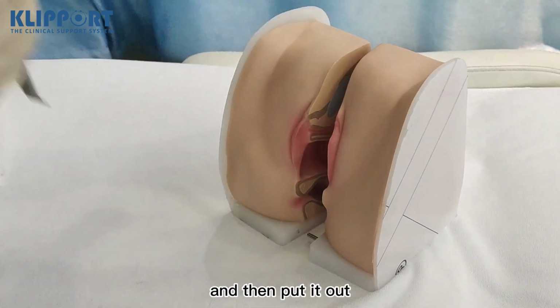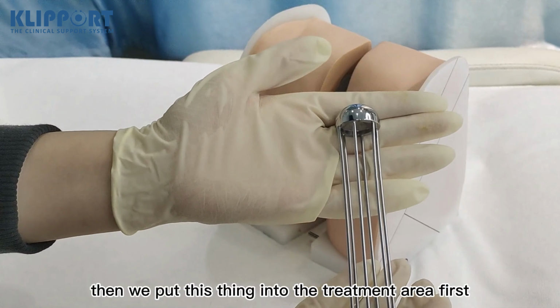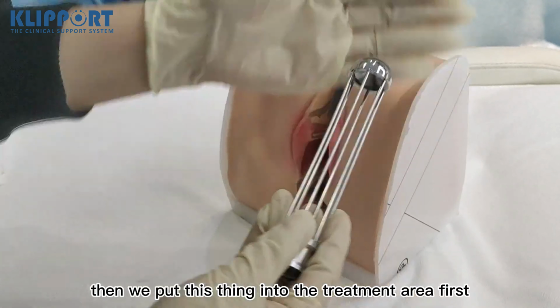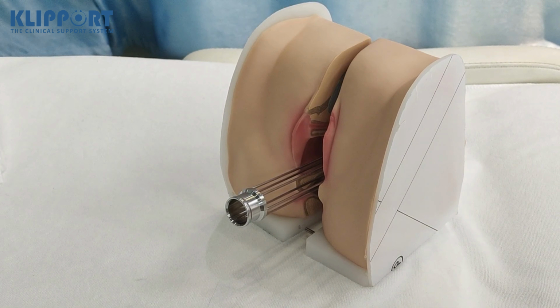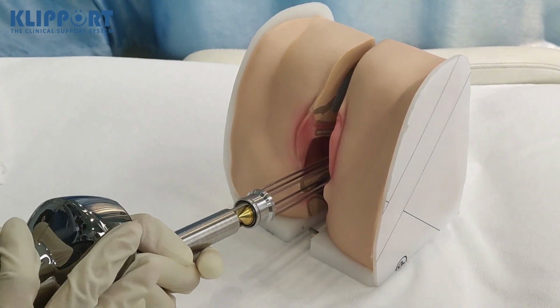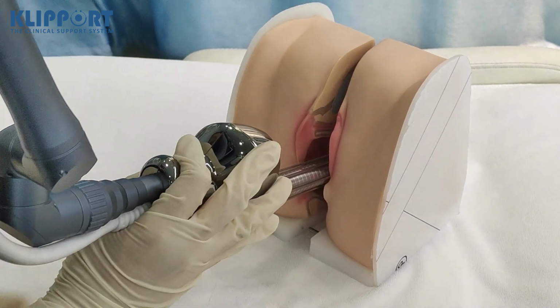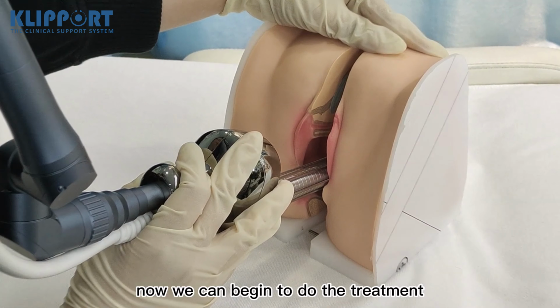And then take it out. Then we put these things into the treatment area first. And then we hold the handle. Now we can begin to do the treatment.